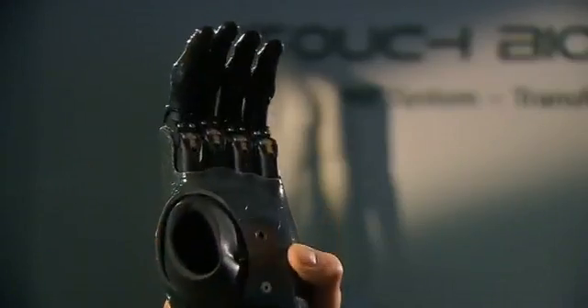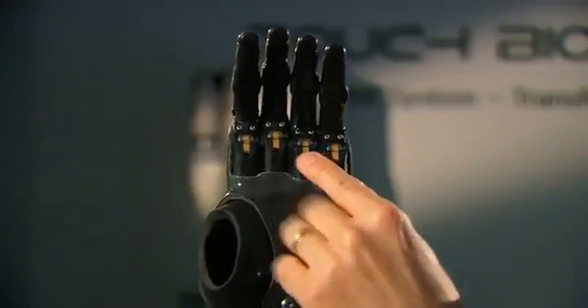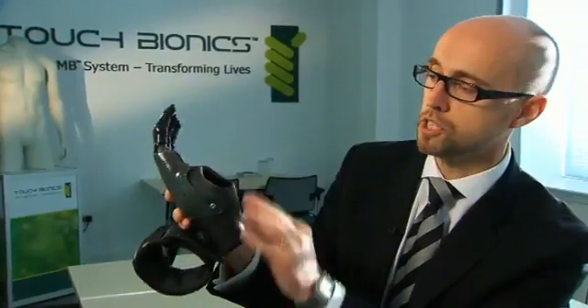If you look at this prosthesis that's been built here, you can see that this is for a user who has got a remaining thumb. So this socket has been built with a soft silicon liner and a hard outer shell in order to provide the mountings for the fingers.